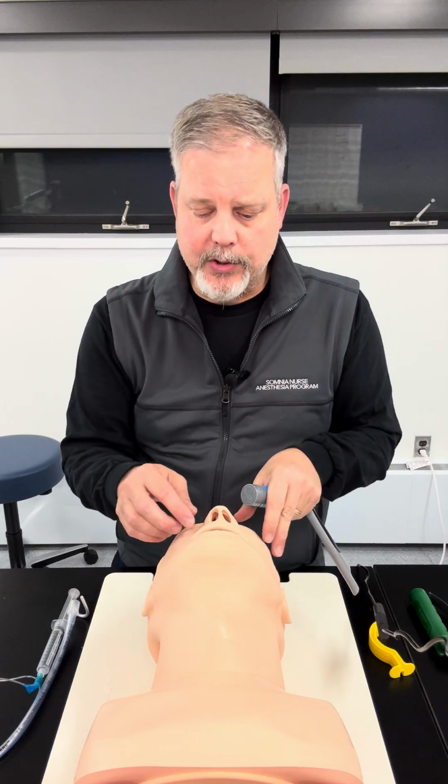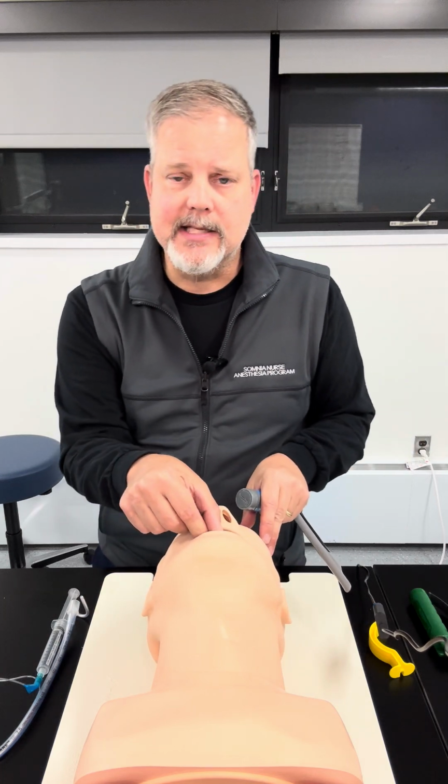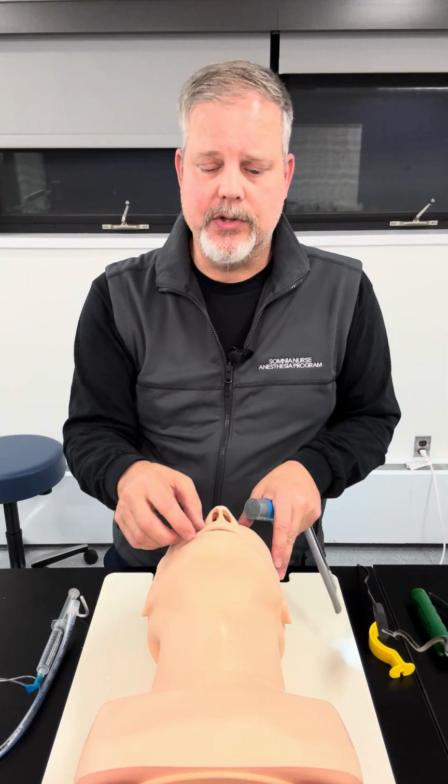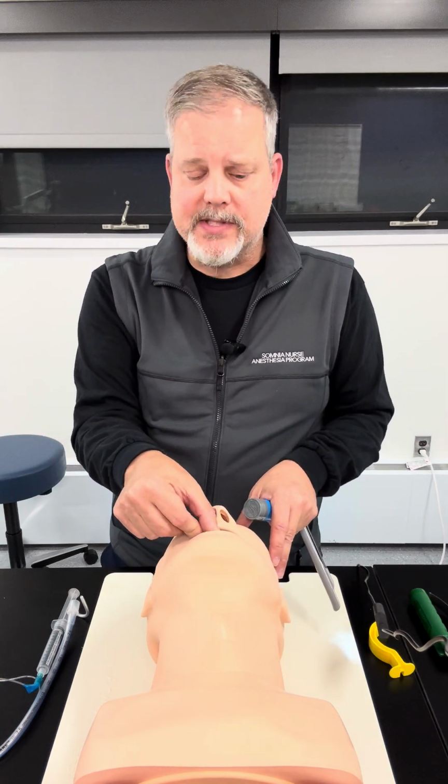The next step we're going to do is scissor the mouth and scissor what's called the teeth, the mouth, whatever terminology is being utilized at your facilities. We're going to scissor the mouth, which really is taking my fingers and putting them in a scissor format so I can actually move them this way. All right, if you can see that in the different angles.